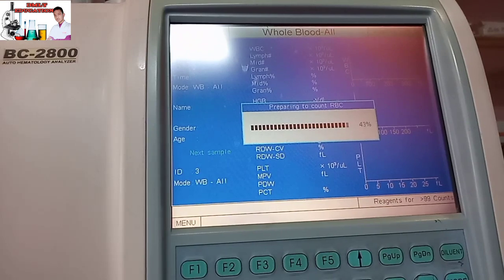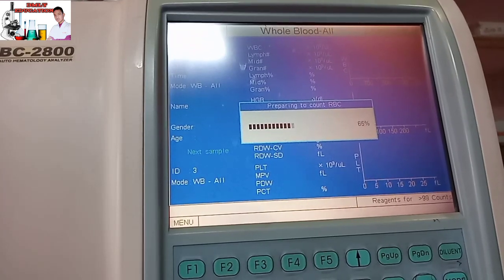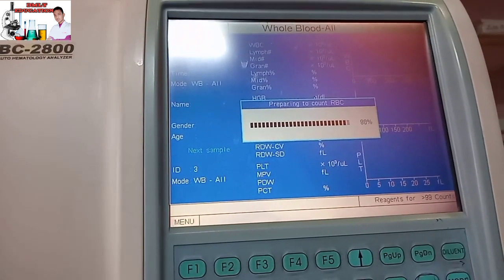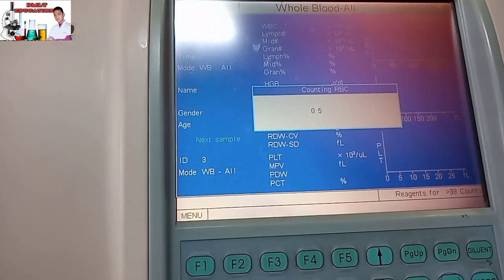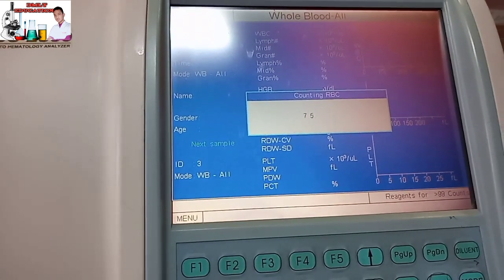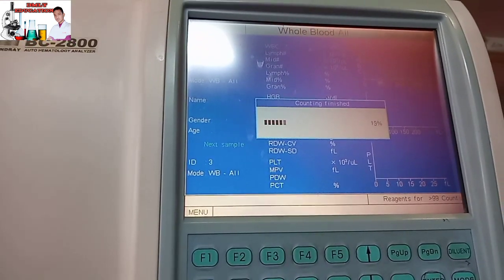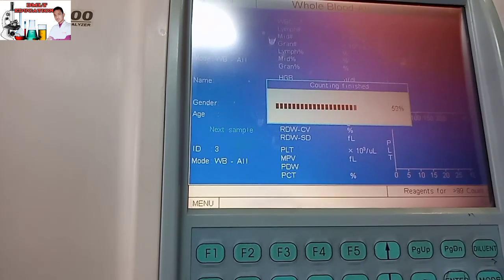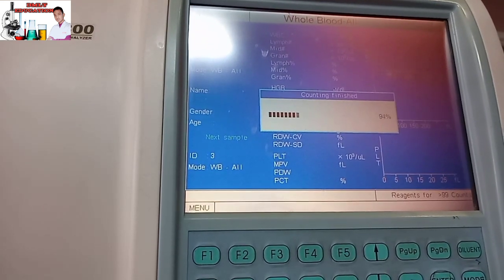Let us start preparing the samples. Counting RBC in these two stages. Counting RBC will be done. I will show you the results.